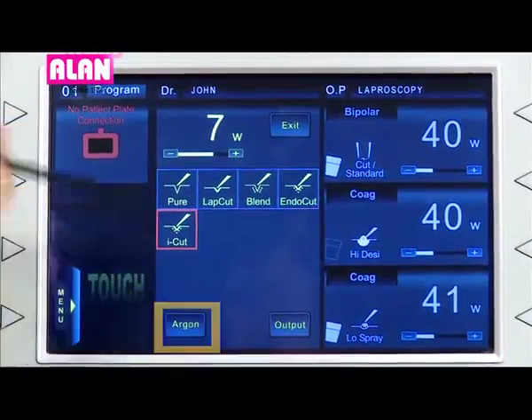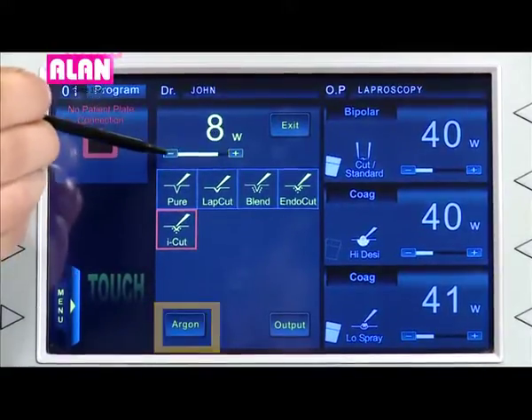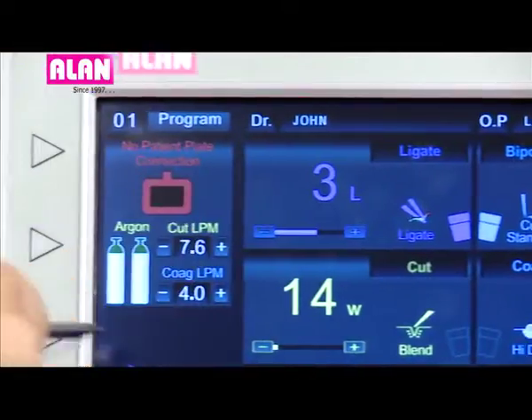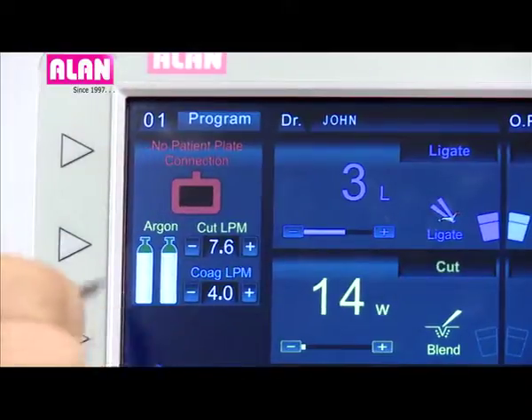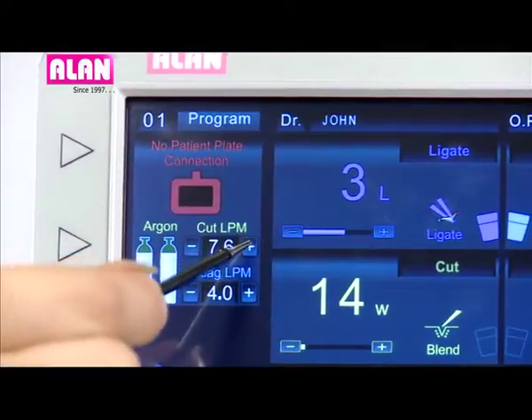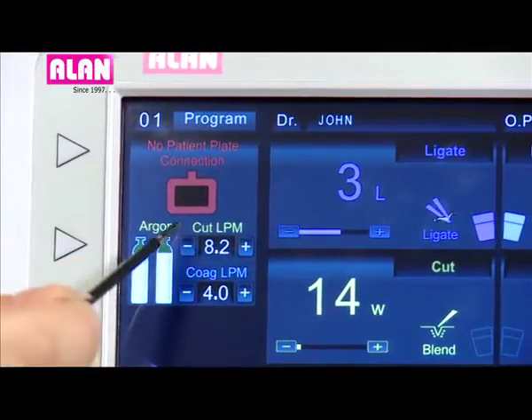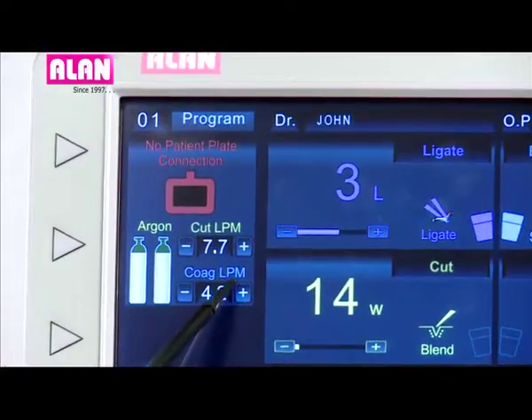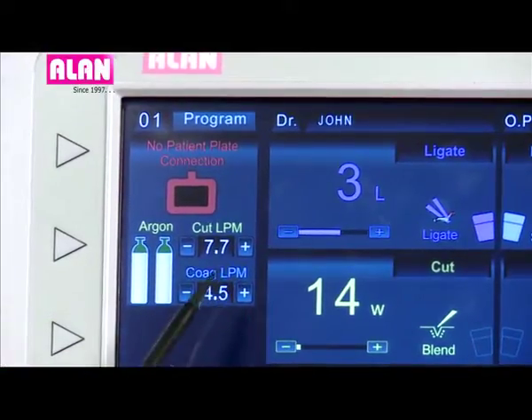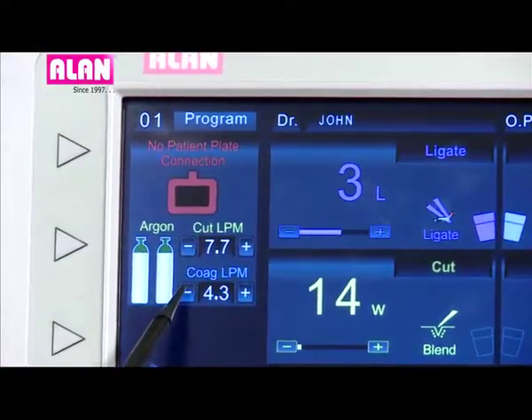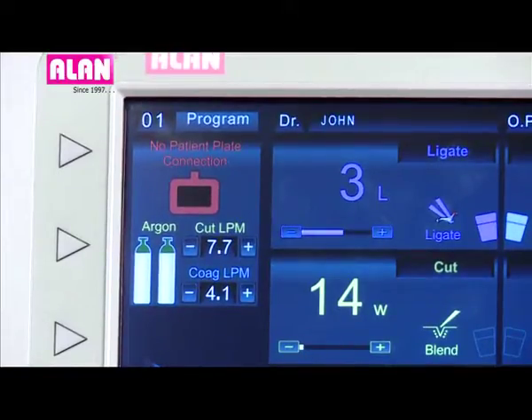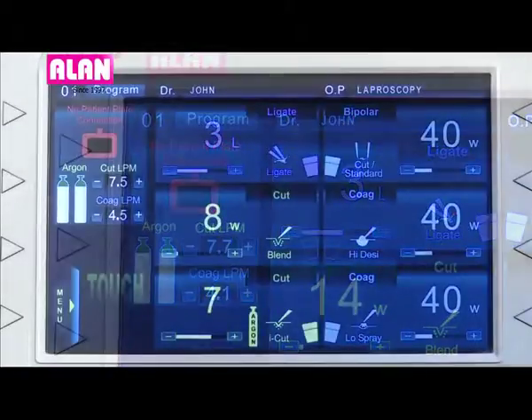Argon can be enabled by touching the argon icon. This argon window shows the selected cut and coag mode LPMs and connected argon cylinder status. LPMs can be varied from 0.1 LPM to 9.9 LPM in both modes individually.